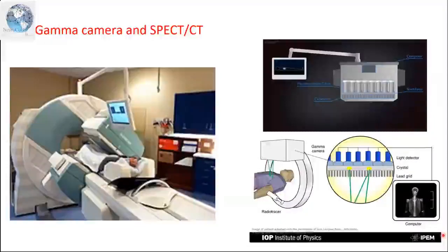Kita detector ni tak boleh detect yang terlalu tinggi punya energy lah, macam yang 511 keV from positron emission tu dia tak dapat lah, dia tembus terus tak boleh get a good image. So this one for lower energy, collimator dia boleh contohnya dalam 300 and below keV. Okay, so contohnya technetium. Technetium 99M is the radioactive material yang paling common guna untuk gamma camera imaging.